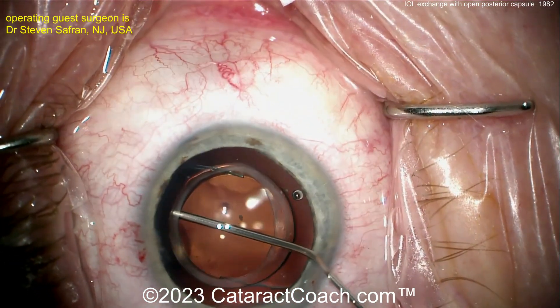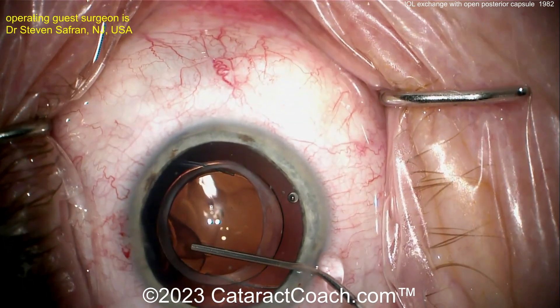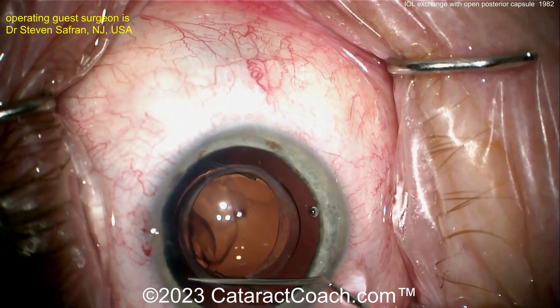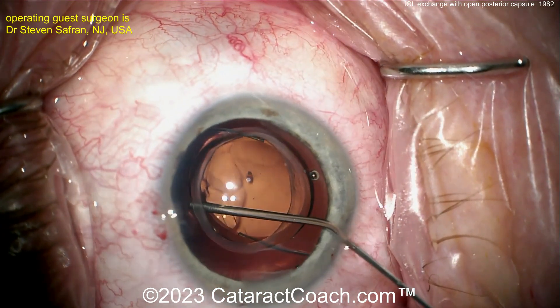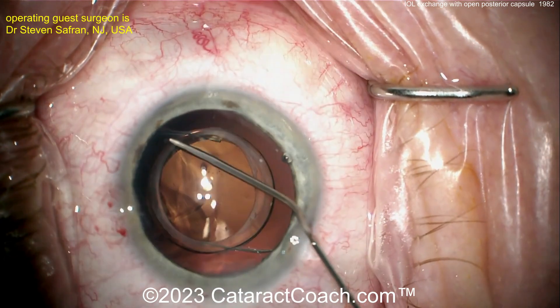The capsular bag is fibrosed, making this a bit challenging to get the lens out. Now putting in more of a cohesive agent — look what happens: the viscoelastic appears very deep in the eye, looking as if it's going into the vitreous.